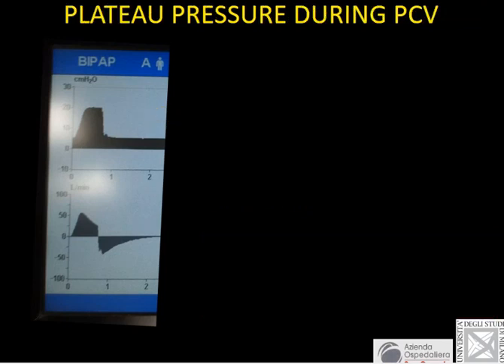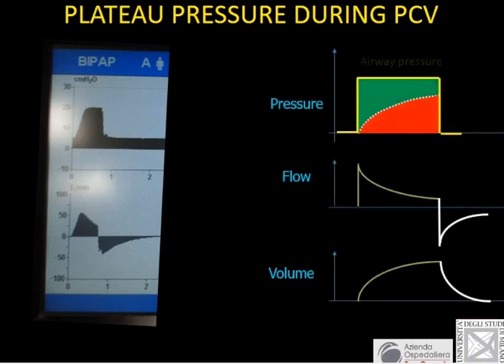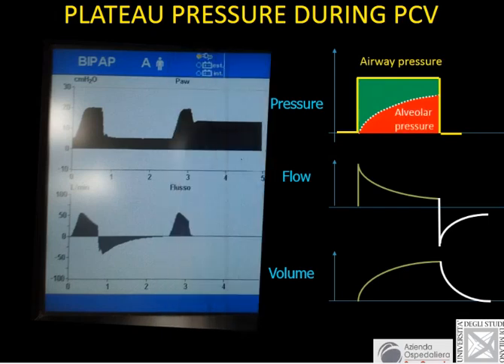What you have to do, you can do in basically any ventilator, sorry, I'm going a little bit fast for the sake of time, an inspiratory hold, and this will reveal to you the true inspiratory pressure. This is crucial, the true plateau pressure in pressure control. This is crucial. Yes, please take a picture.